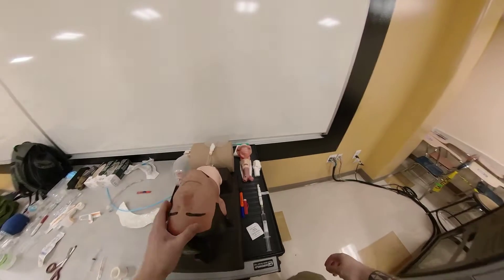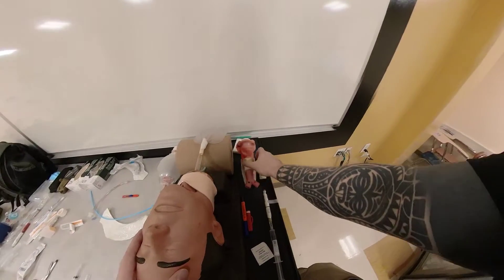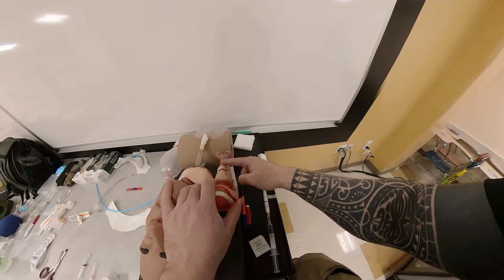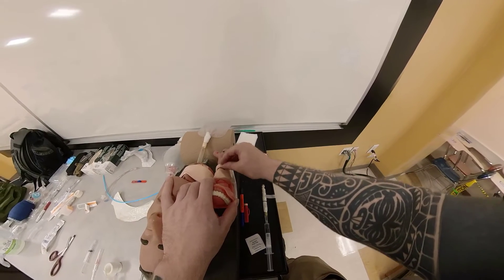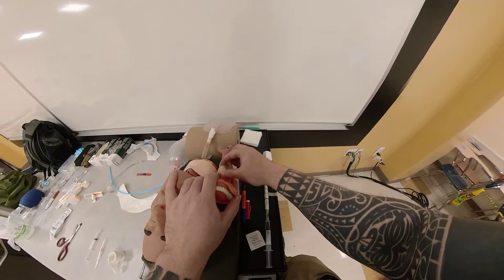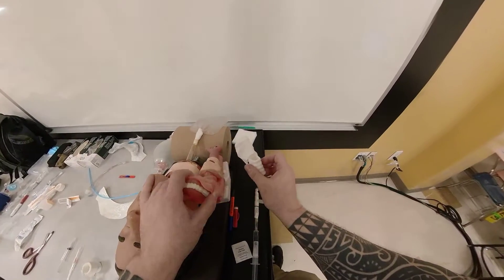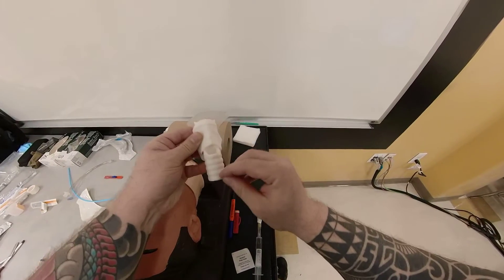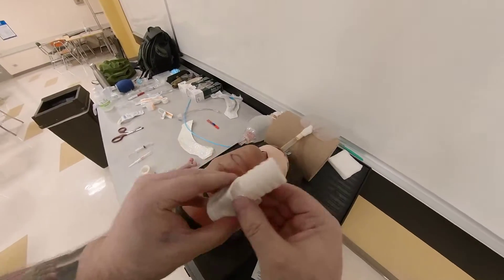The contraindication for this procedure is inability to find the landmarks. The landmark is the cricothyroid membrane. The way you find this site is starting from the sternal notch and working your way up — you're going to find the cricoid rings, which is the hard cartilage. This is the cricoid cartilage, and this prominence here is the thyroid cartilage. Between these two is the cricothyroid membrane, and that's the area you're going to cannulate. This 3D model shows the same airway — you can see the cricoid cartilage, thyroid cartilage, and in between is the cricothyroid membrane that we're cannulating.